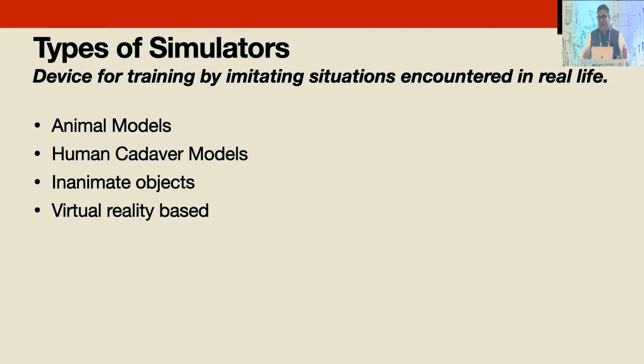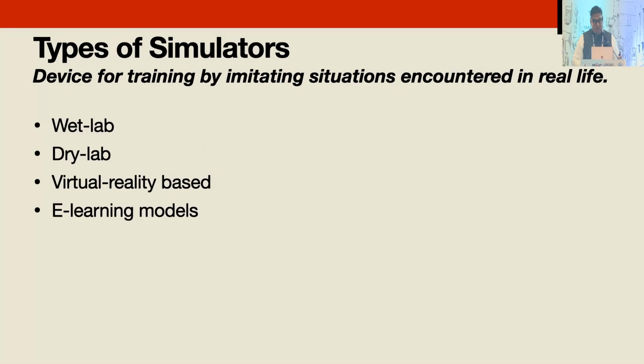See, at the end of the day, every simulator is not a high-tech piece of gadgetry. Any task, object, or process that mimics or simulates the actual surgery or the procedure is a simulator, which is why using even a cellophane tape or an IOL box to practice capsulorhexis is a type of simulation. And all of those would come under the inanimate objects that we have. And finally, we come to virtual reality, which I'll speak about in depth.